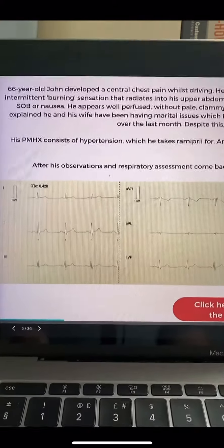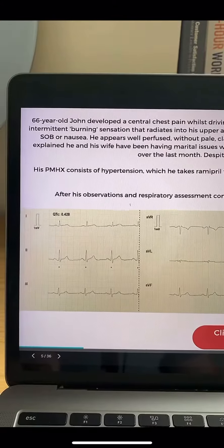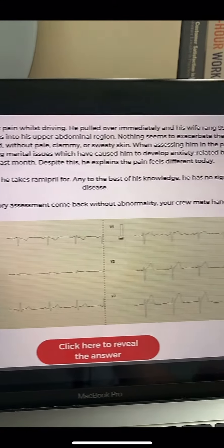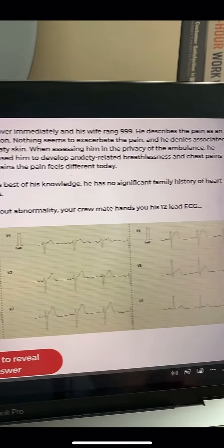Just bear in mind there doesn't have to be reciprocal changes to diagnose a STEMI. Here's an example of a STEMI without any reciprocal changes.